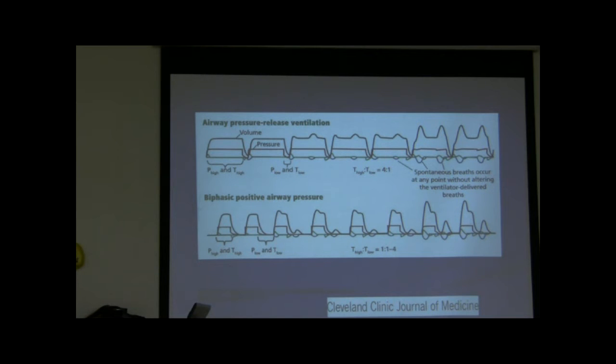Now, this type of mode is different. It's now saying that the PEEP, instead of very low, is going to be actually very high. And instead of pushing the air in to boost up the pressure, now we're starting at high, and we're just going to release the pressure, let the patient exhale, drop the pressure as the form of ventilation, okay?